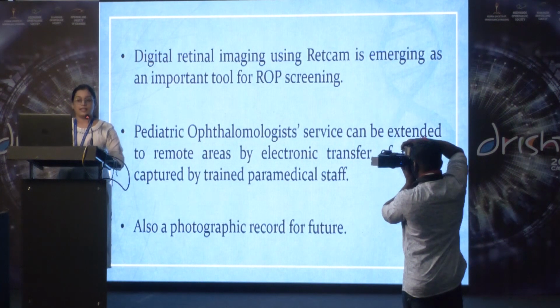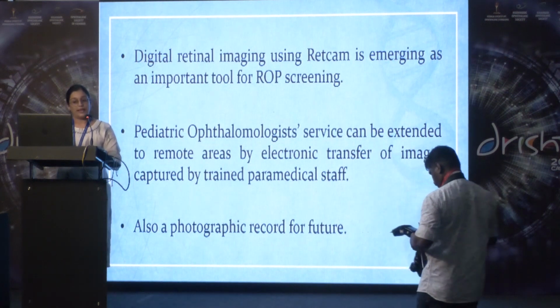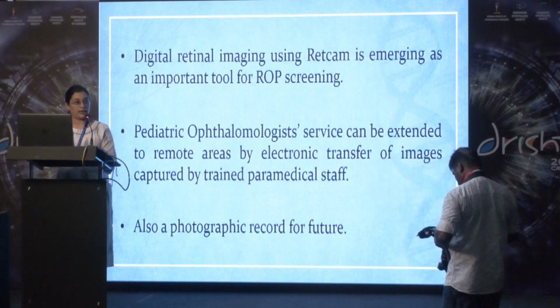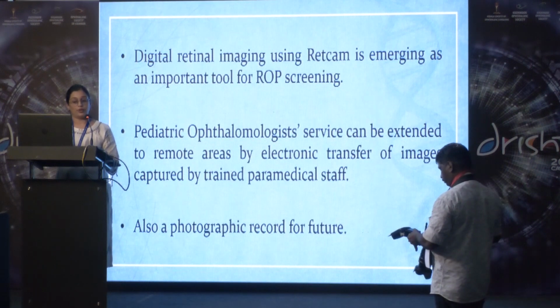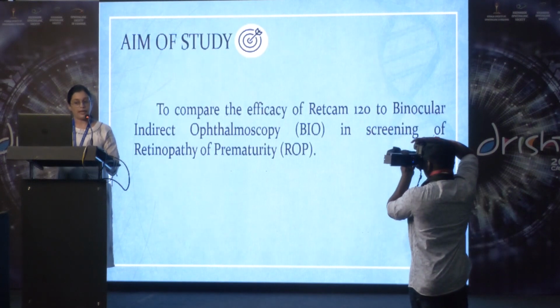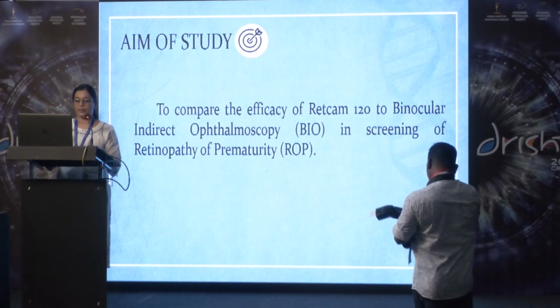In this context, digital retinal imaging using RETCAM is emerging as an important tool for ROP screening. By this, pediatric ophthalmologist service can be extended to remote areas by electronic transfer of images captured by trained paramedical staff. And also, this digital imaging gives a photographic record for future purposes. This study aims to compare the efficacy of RETCAM 120 to binocular indirect ophthalmoscopy in screening of retinopathy of prematurity.